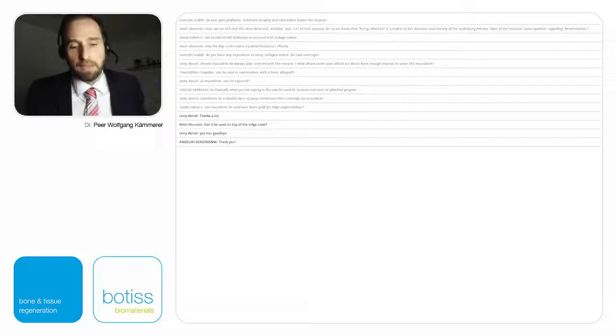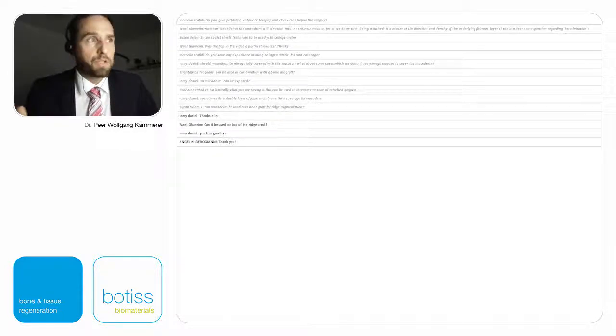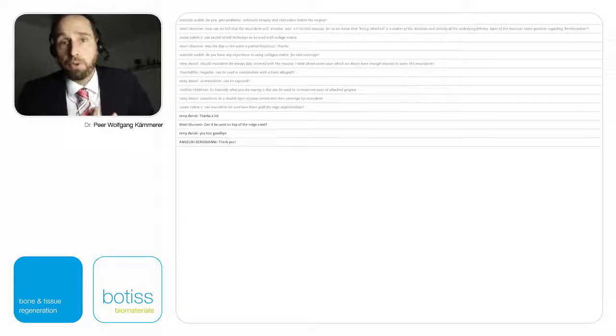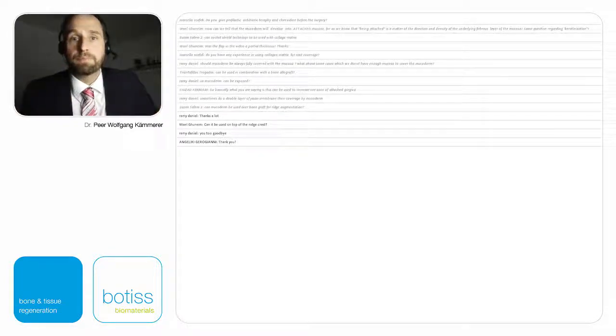But I think that the most important thing when using larger bone augmentation is closure of the soft tissue, full closure. You need it for revascularization, for protection. Mucoderm is not enough for this, from my point of view. But please convince me if you have other results.